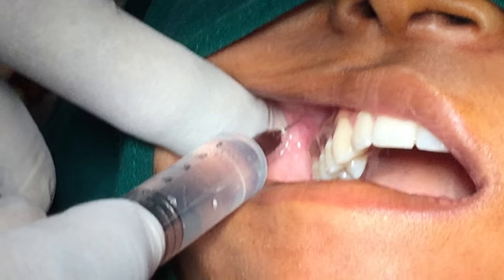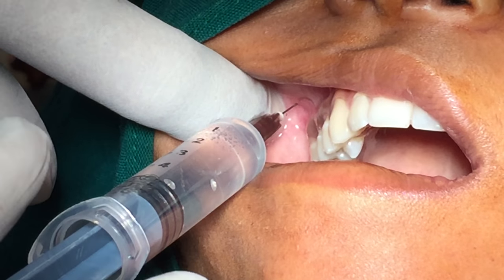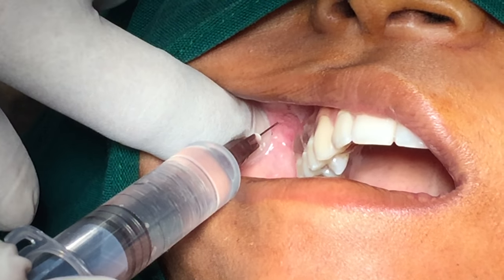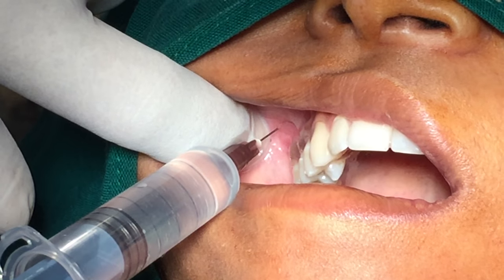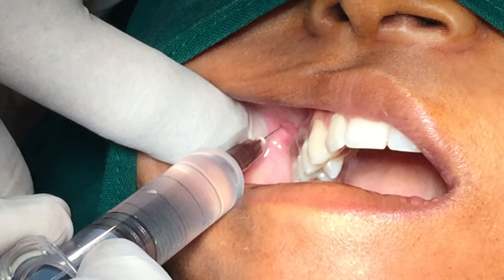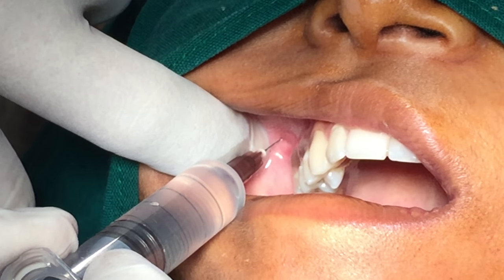Aspirate in two planes, rotate the needle bevel, and then re-aspirate. If both aspirations are negative, slowly deposit 0.8 to 1.8 ml of local anaesthetic solution.